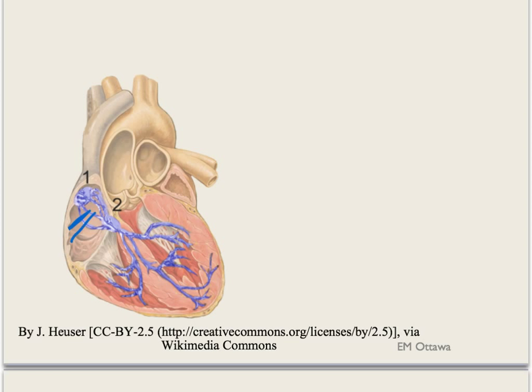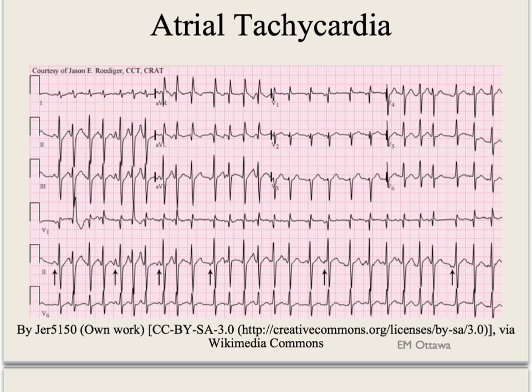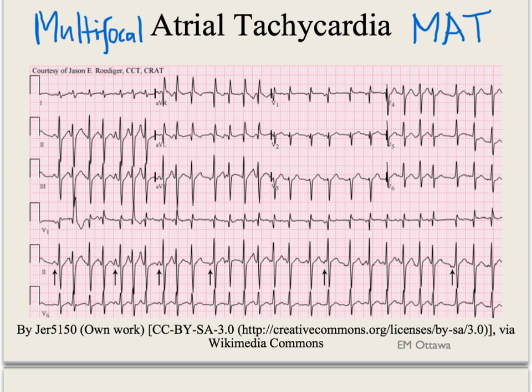Moving on to the atrium itself — this is atrial tachycardia. The QRS is irregular and narrow. This is also known as multifocal atrial tachycardia, or MAT. What happens here is that there are different pacemaking foci in the atrium that contribute to different-looking P waves. If you look at lead 2, the arrows are showing there are at least 3 to 4 different-looking P waves, since each different P wave is coming from a different focus in the atrium. Since there are different foci, the QRS is not exactly regular.